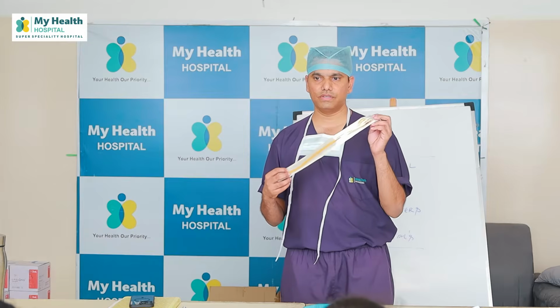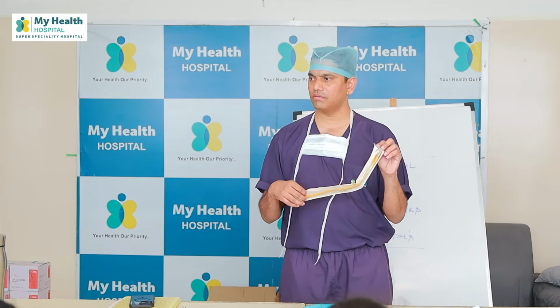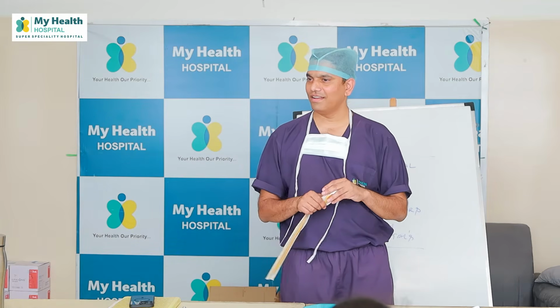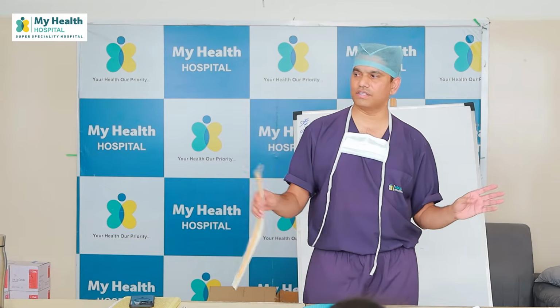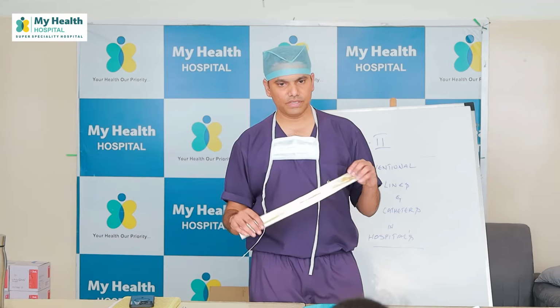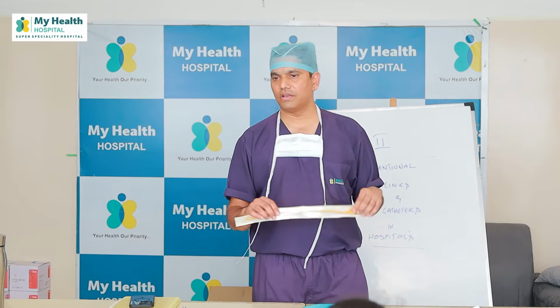What is the size of this thing? How do you know? Color, universal colors are okay for these interventions. Indications: drainage.